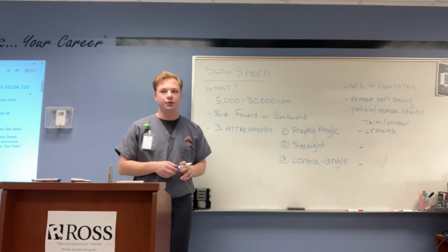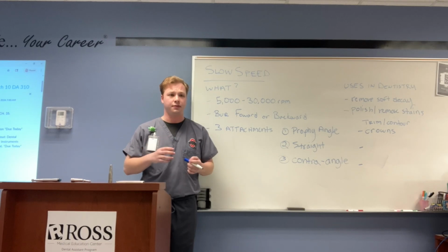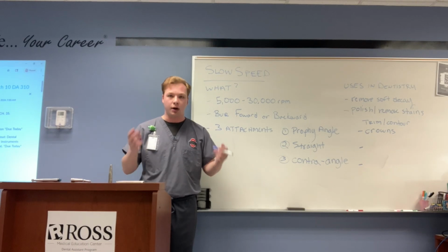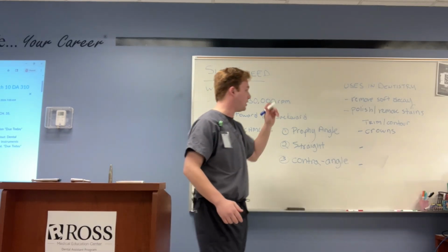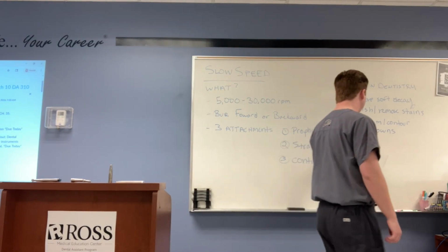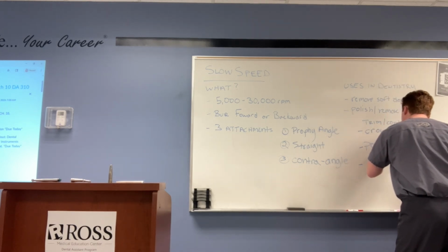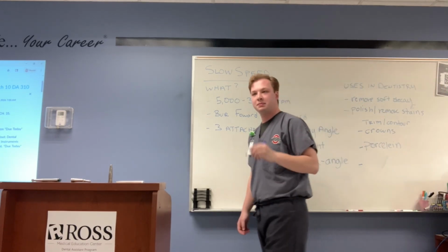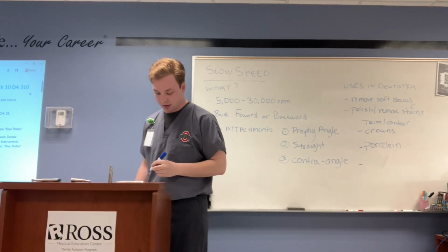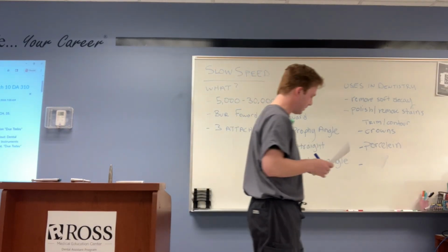Now nowadays, with modern lab techniques, we don't often mess around with porcelain fused to metal crowns. However, if you were to encounter one, you would want to make sure to use a slow speed handpiece. When we're talking about porcelain, I don't know how to spell porcelain, but you guys can look that up for me.